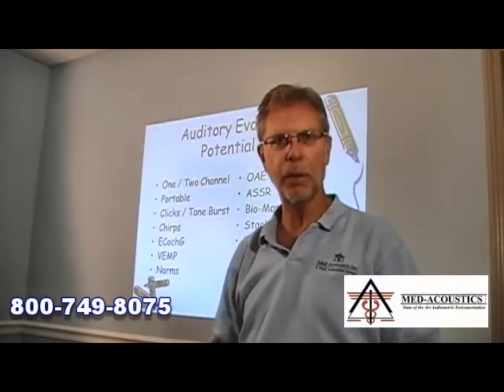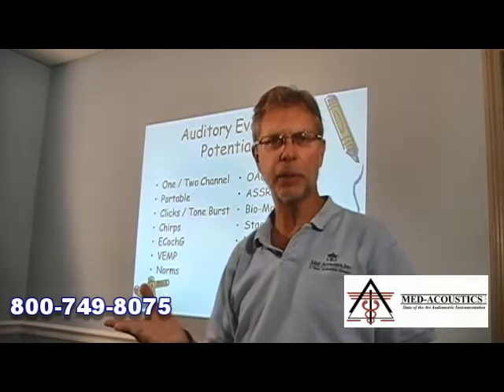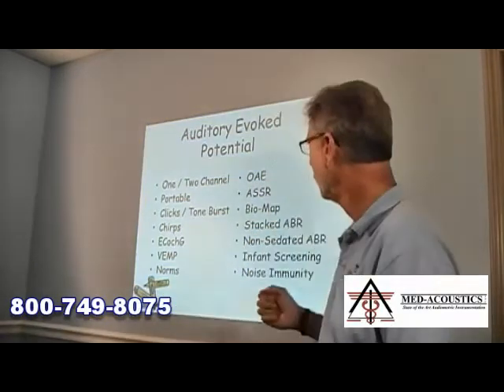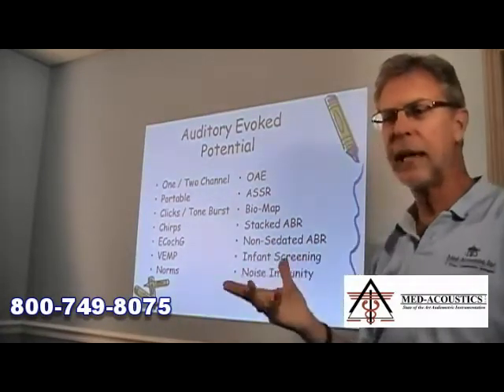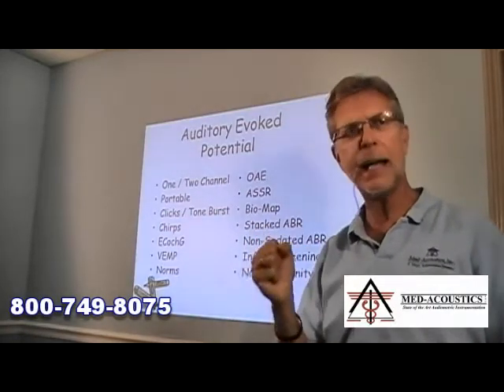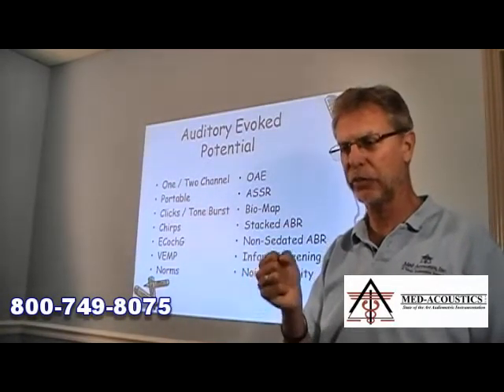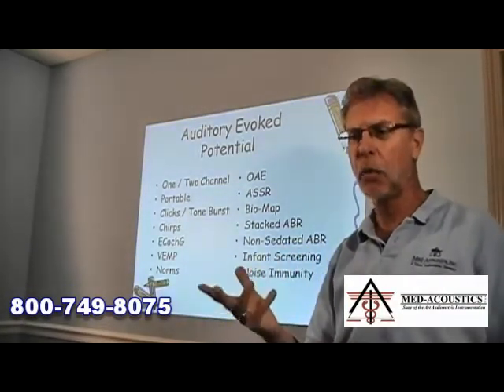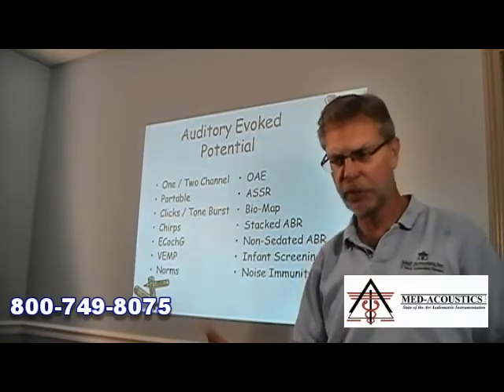Biomap and stacked ABR were two things that were pretty hot several years ago, but today they have disappeared. Actually, the FDA has taken those off the market. They need more research. All right, so those two are no longer considerations, though they were just a few years ago. Will I be doing non-sedated ABRs? Non-sedated pediatric ABRs? If I am, then there are very, very substantial considerations to make when purchasing the equipment. Certain features are going to make that a more viable application than if you don't have these features. Okay? And some systems have them, some don't.